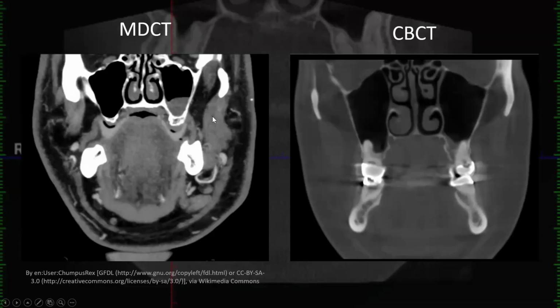When I talk a little bit later about MRI, MRI is kind of the gold standard for looking at soft tissue contrast. But CBCT is really good at looking at hard tissue contrast, which for dentists, that's mostly what we're concerned about. In our radiographs, that's mostly what we're looking at, right? And when we're implant planning, you really want to see where that bone is. And so we have as good or better in some cases spatial resolution compared to medical CT. And so for purposes as dentists, and actually ENTs are starting to adopt more cone beam CTs. It shows really good spatial representation of the inner ear ossicles, all the different inner ear structures that they may be looking at. The sinuses, of course.